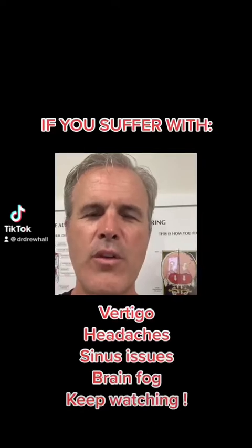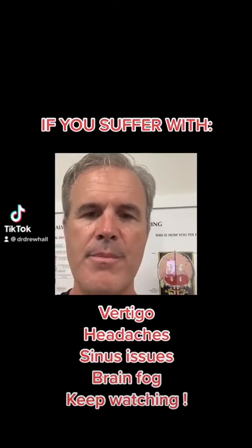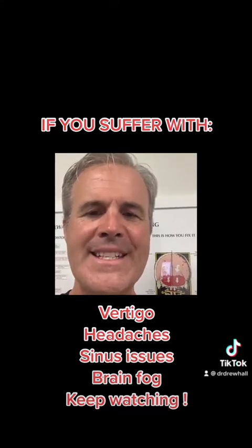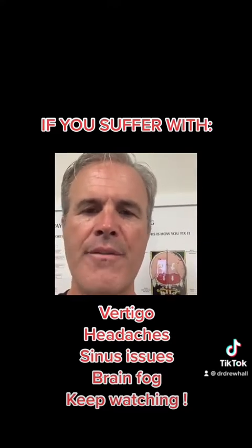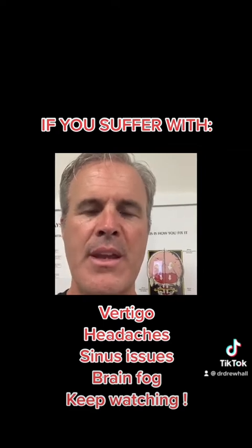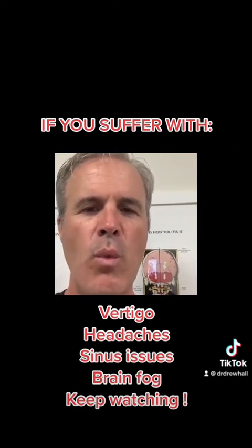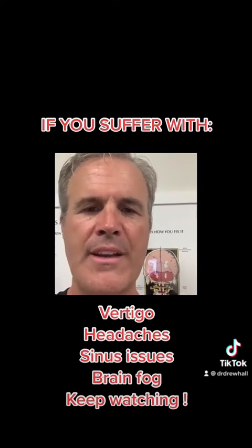Are you suffering with chronic headaches, chronic sinus problems, chronic cognitive issues? I'm going to show you a 3D CBCT scan that we use in our office from a patient that just recently came in with all these kinds of conditions. And we're going to show you how and where structural issues in the neck affect the nervous system and what you can do. Looking at here is a 3D image.